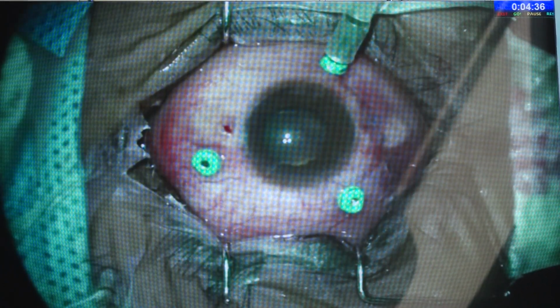So you can see the scleral wound which has been repaired, involving zone 2 and extending into zone 3. So we placed our sclerotomies slightly away from the wound so that we can approach this area of incarceration, as the retina is all dragged up into the wound and the vitreous is going into the wound. After doing core vitrectomy, we use our cutter and induce the PVD and extend it all around.